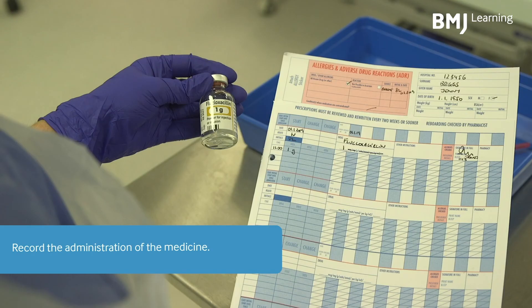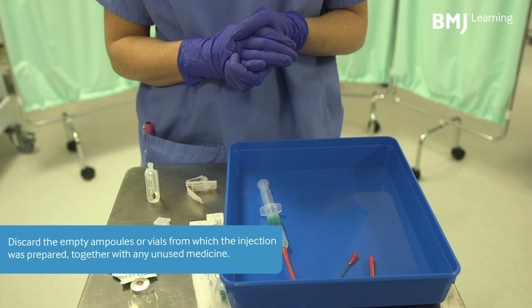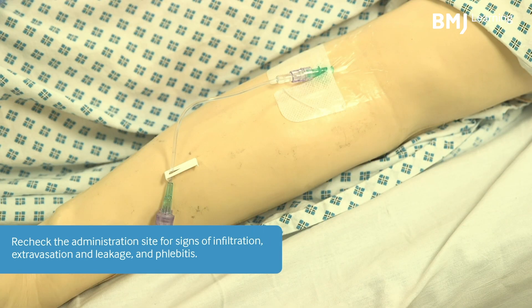Record the administration of the medicine. Discard the empty ampules or vials from which the injection was prepared together with any unused medicine. Recheck the administration site for signs of infiltration, extravasation, leakage and phlebitis.